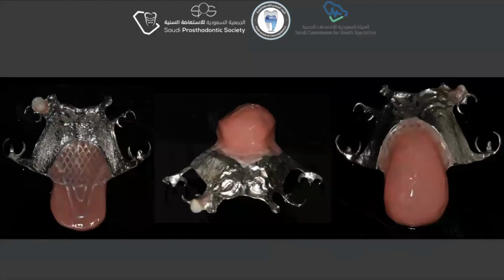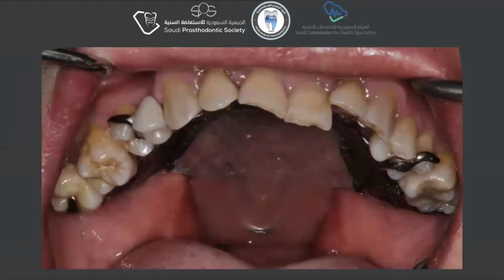The maxillary obturator and the speech aid device were delivered to the patient, and a 3-month follow-up was scheduled to evaluate the periodontal health and ensure the hygiene compliance of the patient, to intervene early if the patient fails to keep a clean environment. And in order to get the maximum benefit as a speech aid device, the prosthesis was relined frequently using impression wax, just barely touching the posterior pharyngeal wall.